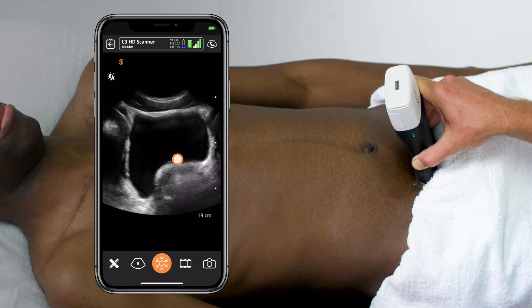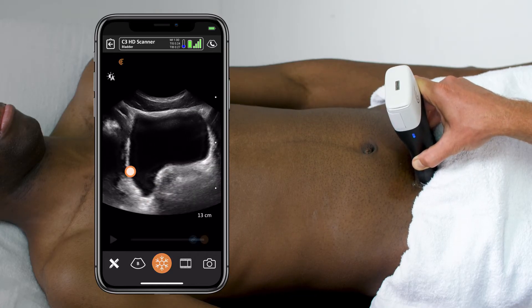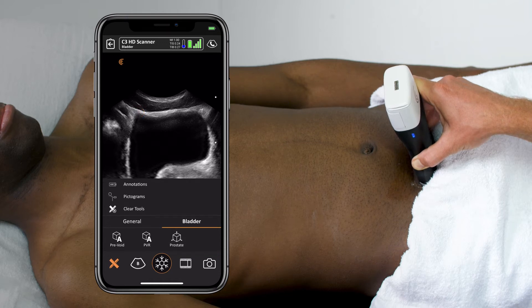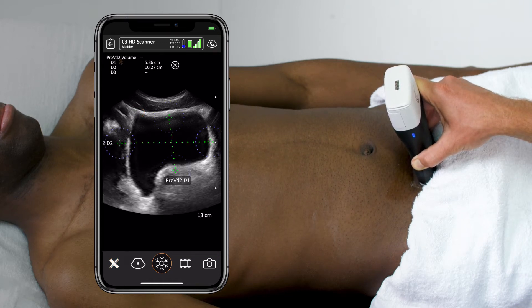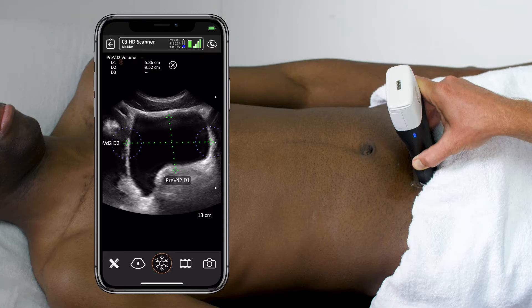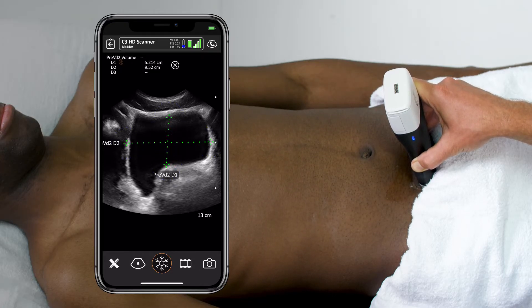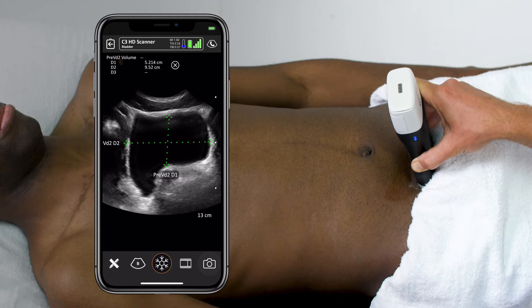Once I get its maximal diameter in view, I can freeze the image and put on my calipers. I can choose pre-void or post-void residual as necessary and start placing calipers on. When I click on the image, the set of calipers will show up, and I just have to slide them into place. Once I get my cross marks roughly in view.